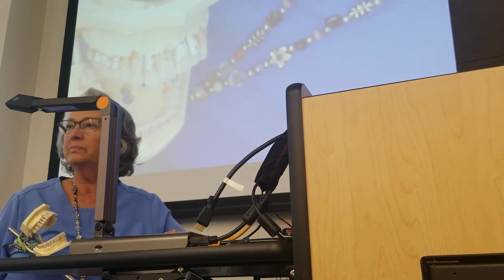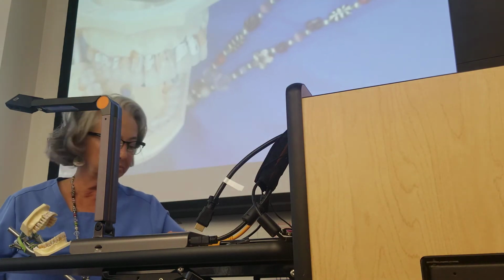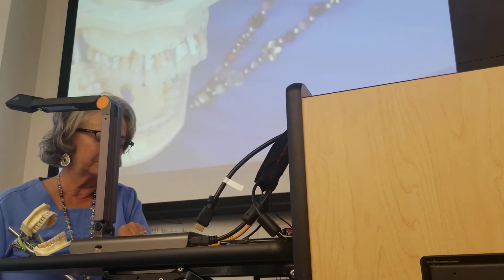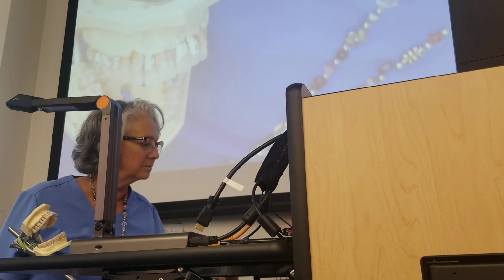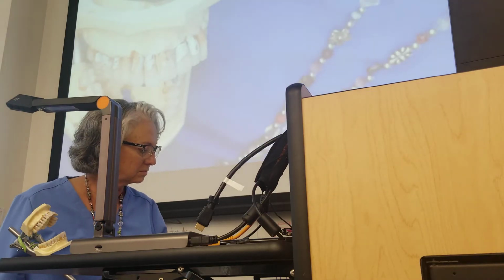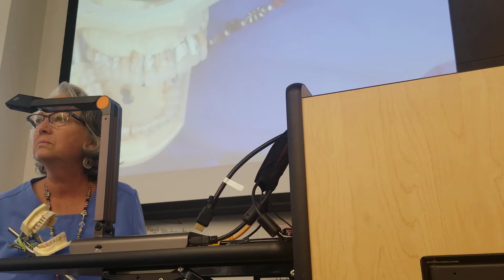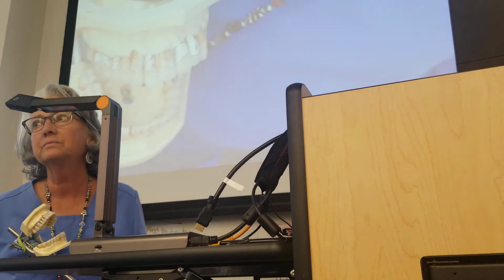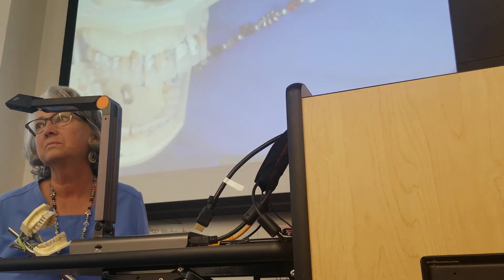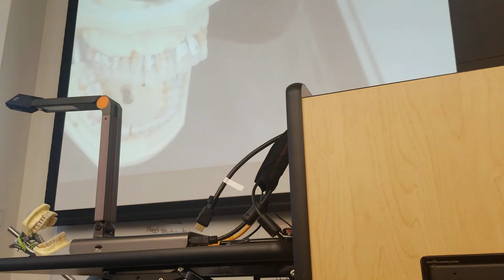So we'll do all the surfaces towards and all the surfaces away. A little more, because you're right up there. About halfway in. Oh, you're right, when you see it there, it looks different. As close as you can get it. So, start in and then tilt.